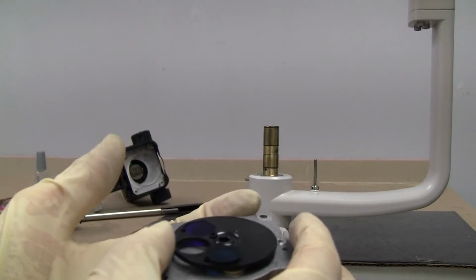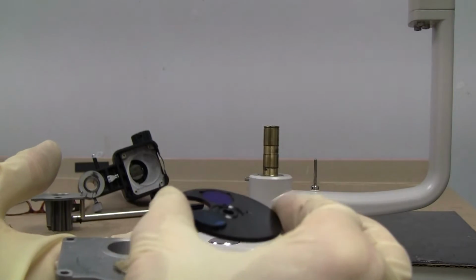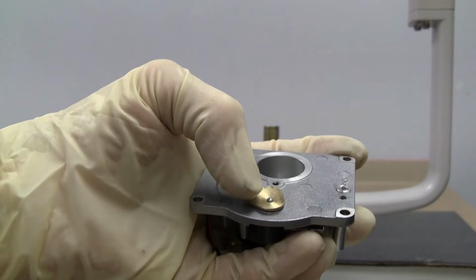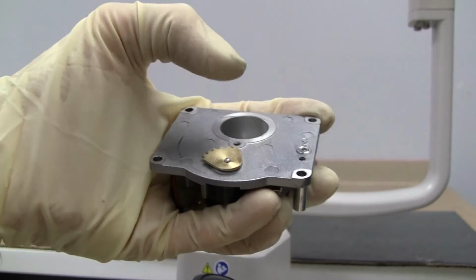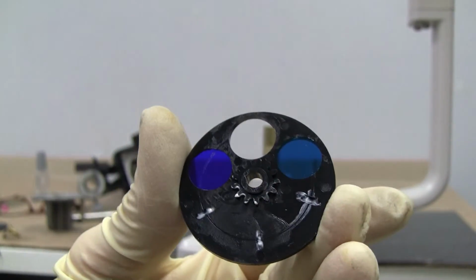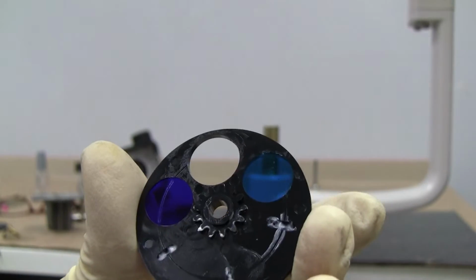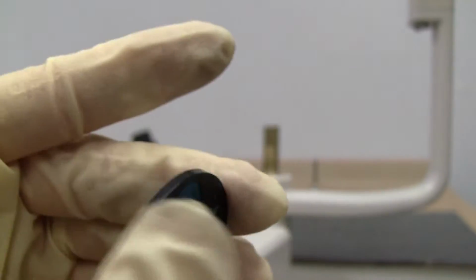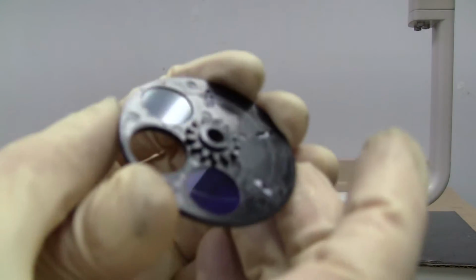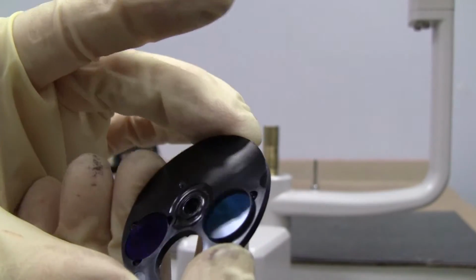Okay, we've taken our top screw off, our diaphragm wheel. The gear is fine, the bearing inside the gear, that's also a detent bearing, that's okay. Looking underneath, looks like we've got some issues. Oh boy, doesn't look good. Well, I think the lens is in correctly. So it's not a lens issue.